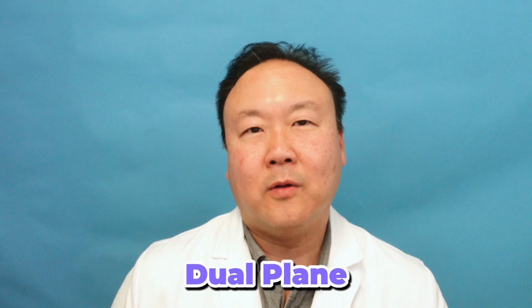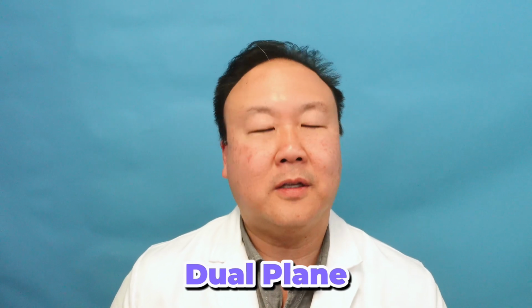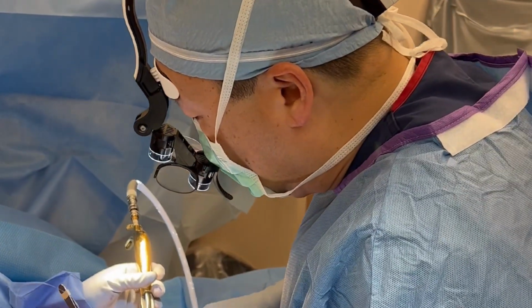So currently, the most common placement around the world is actually dual plane. We know it, we like it, it's a known quantity, it's being taught everywhere. And for many years, I did dual plane. I do think that the future is subfascial, or underneath the fascia, because I love the control. I love the fact that I can generate a little better cleavage.